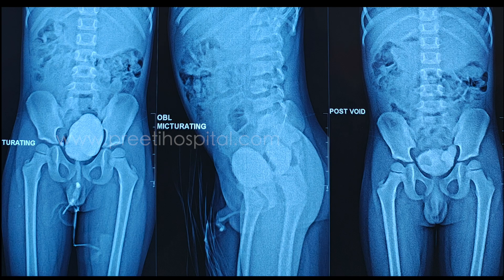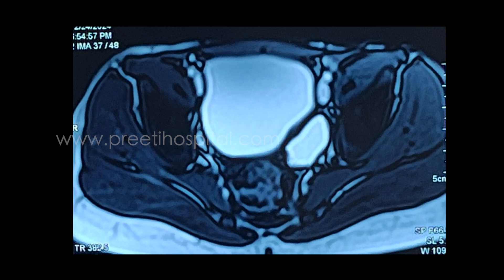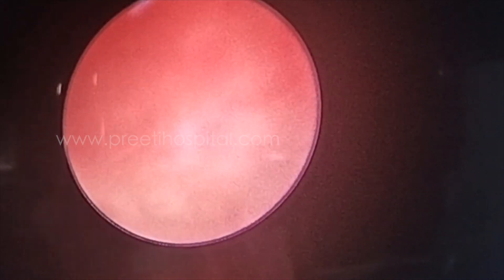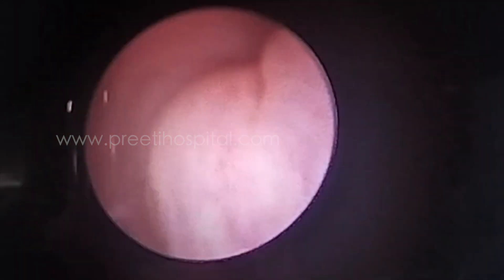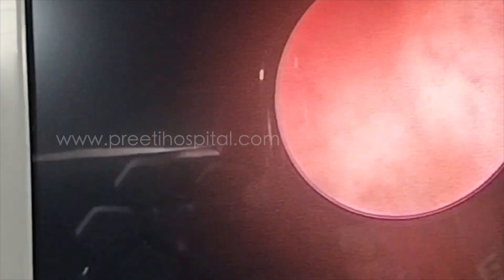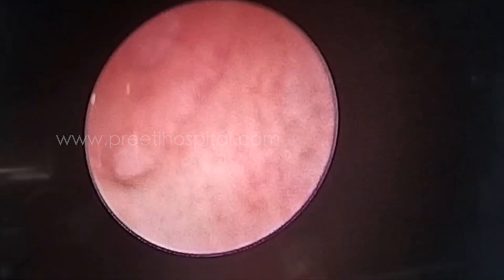On CT and MCUG, you can appreciate that the diverticulum is slightly above the ureteric orifice, and the ureteric orifice on MRI is not affected. On cystoscopy, the ureteric orifice is well away from this thin-walled diverticulum.